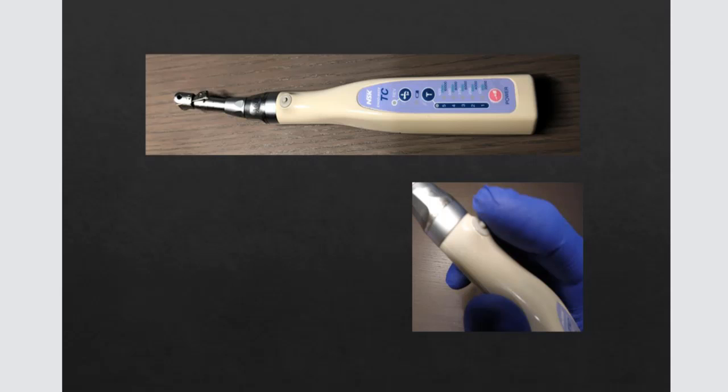You could adjust torque control, and it had nickel metal hydride batteries that would easily hold a charge for a week without loss of power. So, I mean, basically I would charge this every week. I would do 5 to 7 cases and not have any worry about the batteries dying. And when they did die, you could easily replace them.